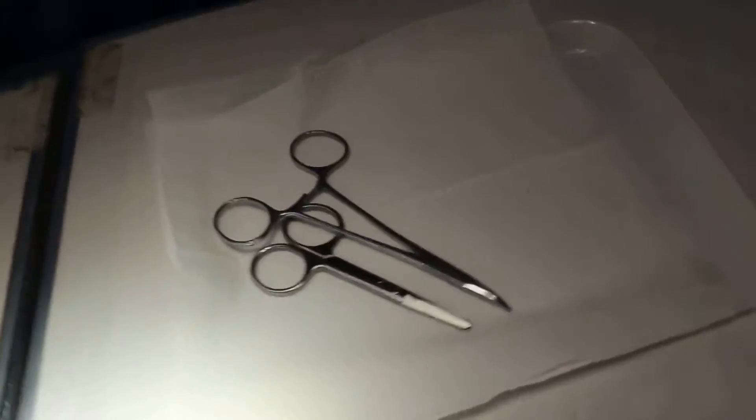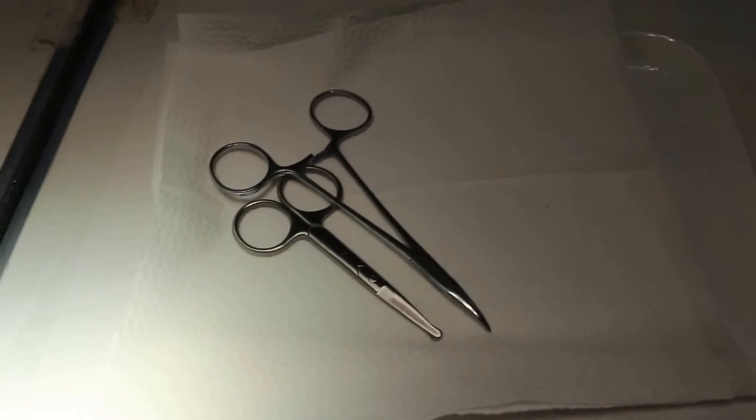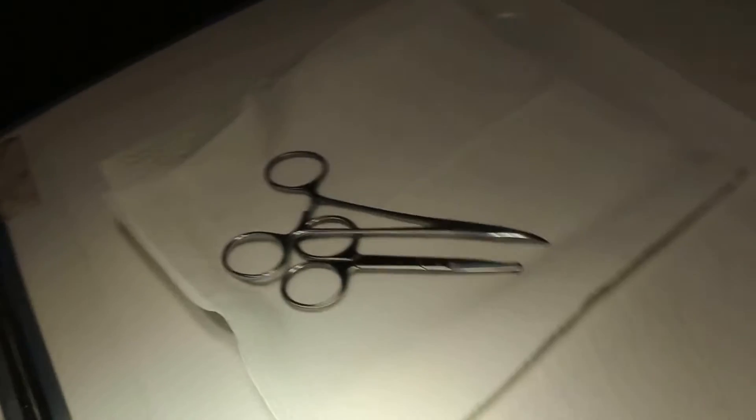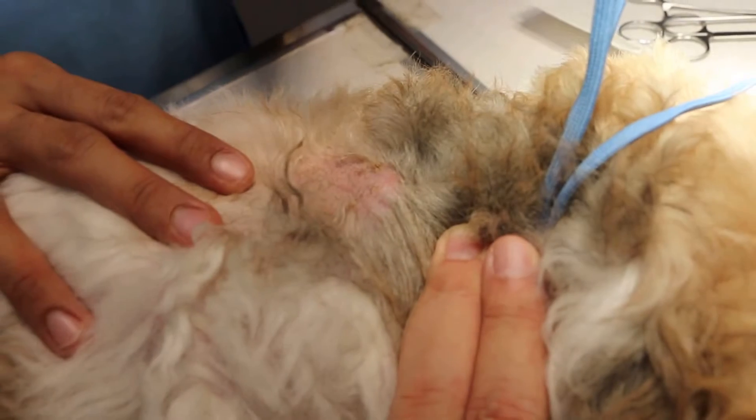The instruments to use are the sterile scissors and forceps. To collect the sample, I will use my fingers and thumb — clean ones — to handle the hair.